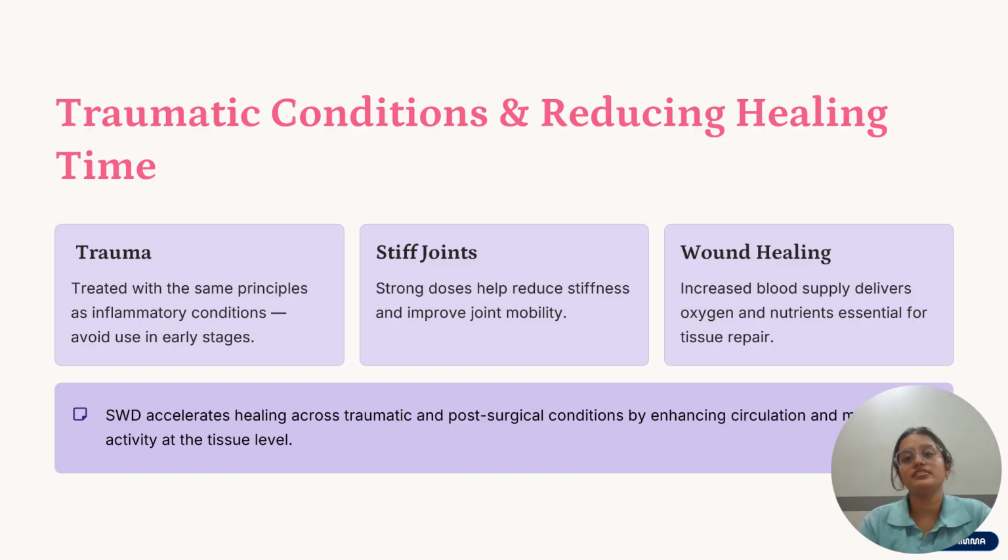So, traumatic conditions and reduced healing time. Trauma is treated with the same principle as inflammatory conditions; avoid use in the early stages. Stiff joints: stronger doses can be applied in the case of stiff joints, which improves joint ROM and mobility and reduces stiffness.